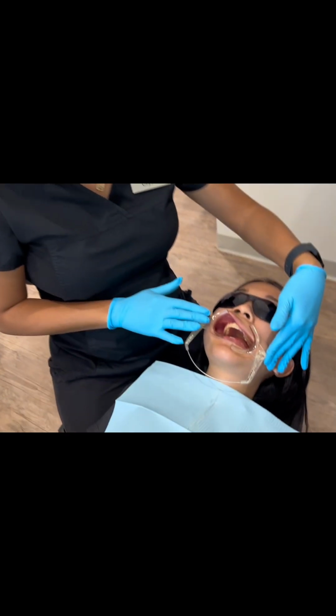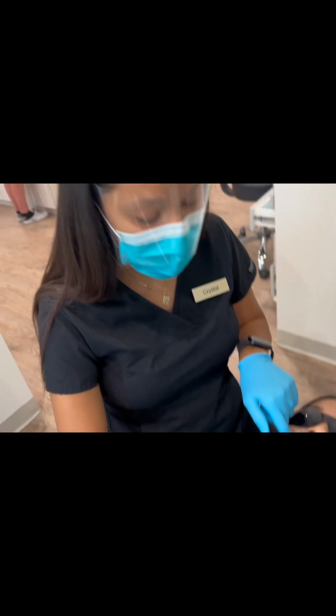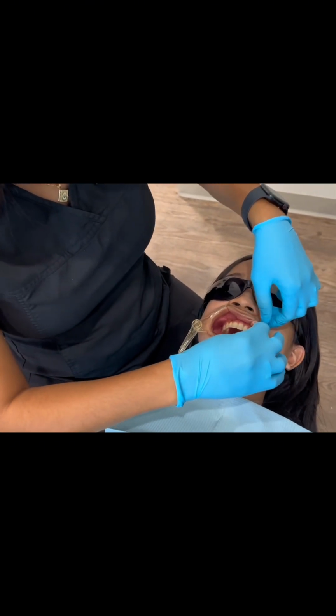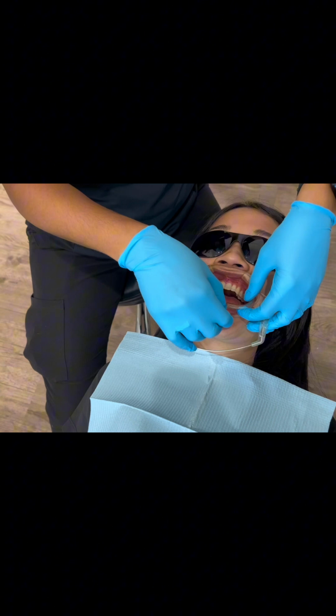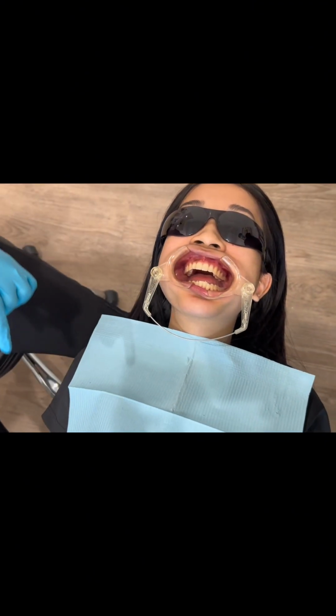You see here, I have it lopsided. She doesn't even know that, okay? So just put the flaps in on the cheek retractor and then get the lip around it and take your time with it, okay? Don't struggle with it.